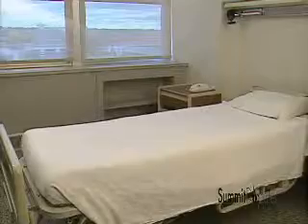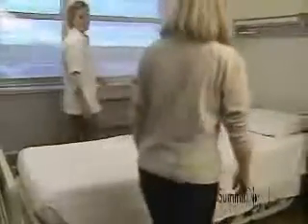Prepare the patient for the exam by having them take off their shoes and socks.